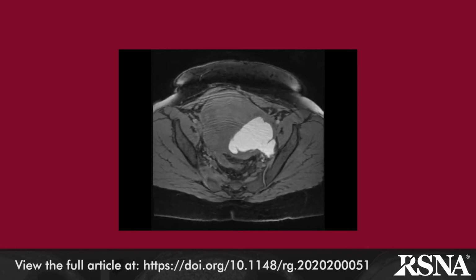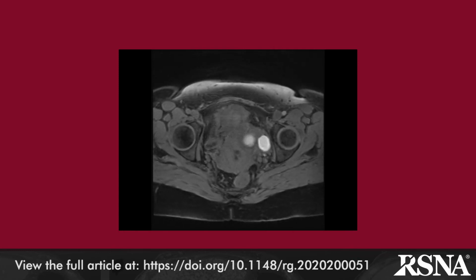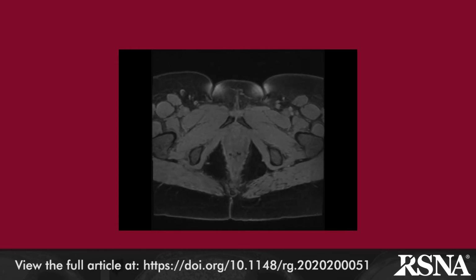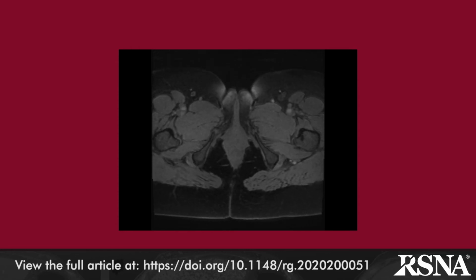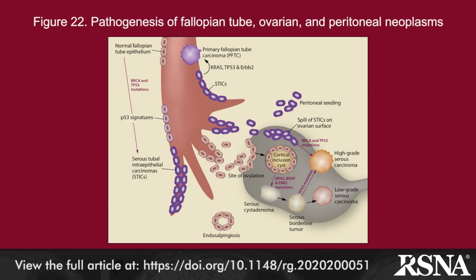In this video, demonstrating post-endometrial ablation tubal sterilization syndrome in a 48-year-old woman, a post-contrast T1-weighted MR video clip obtained in the axial plane demonstrates an enlarged uterus with a complex hyperintense fluid collection in the endometrial cavity compatible with hematometra, denoted by the red asterisk, and bilateral dilated tubular structures with hyperintense fluid, indicating hematosalpinges, marked by the yellow arrows. The section concludes with a discussion of imaging findings following tubal occlusion procedures.